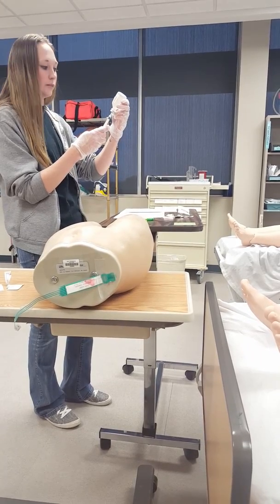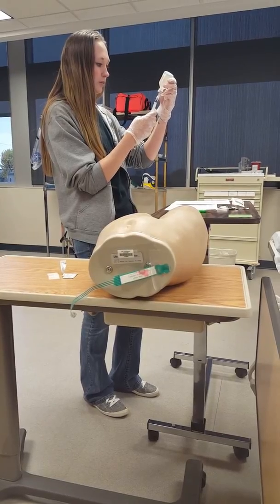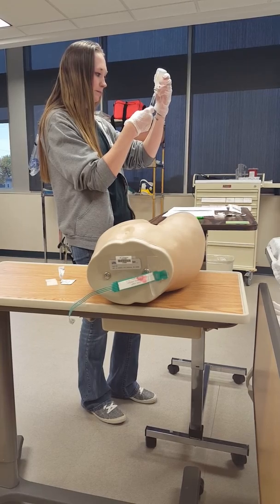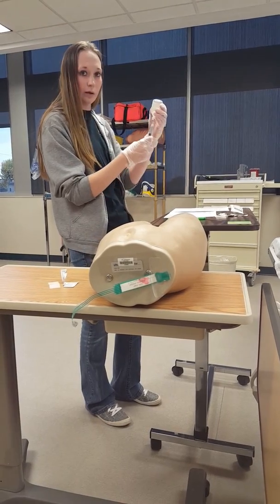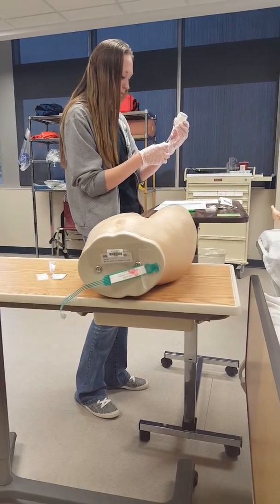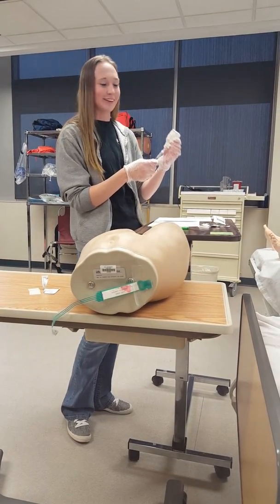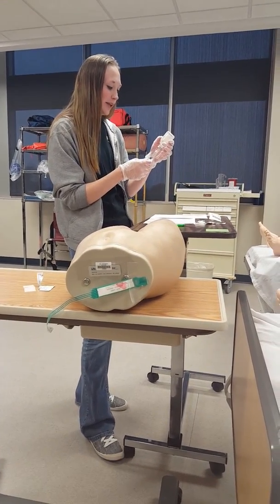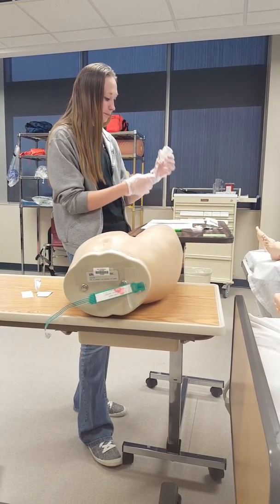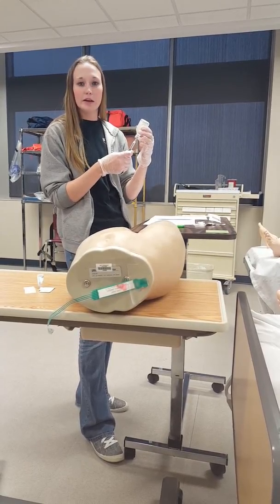Then I'm giving 2 mLs of this. So I draw this up to 2. Make sure there's no bubbles. And then I'm going to check it to my MAR. So I'm giving Novolog 2 mLs, and on my MAR, sorry, I'm giving Demerol, not Novolog, I already did that one. So I have Demerol, and I'm giving 2 mLs, and then on here it says Demerol, and I'm giving 2 mLs.